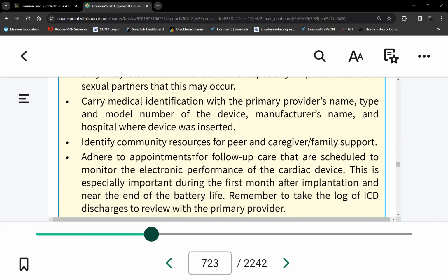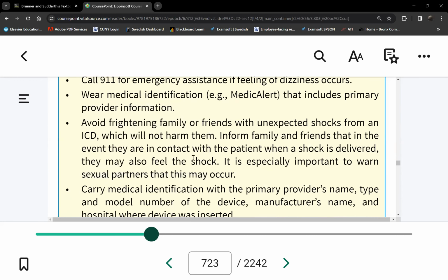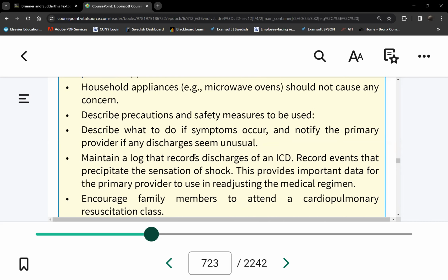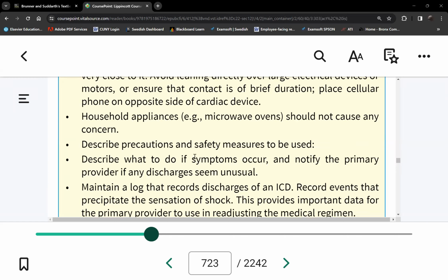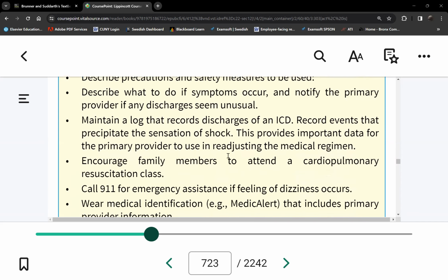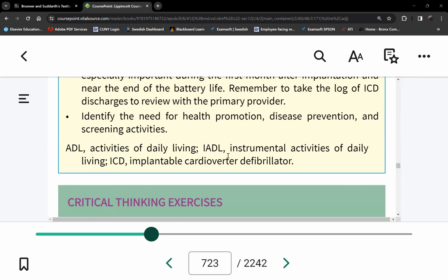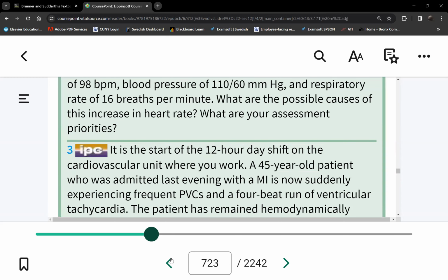These devices, both the pacemaker and the ICD, are checked at least twice a year, once every 6 months. There are two companies we have here. We have St. Jude and Medtronic. Okay, so I forgot the term this morning. So Medtronic and St. Jude are the two big providers of ICDs and pacemakers in North America. Okay, so we finished that.